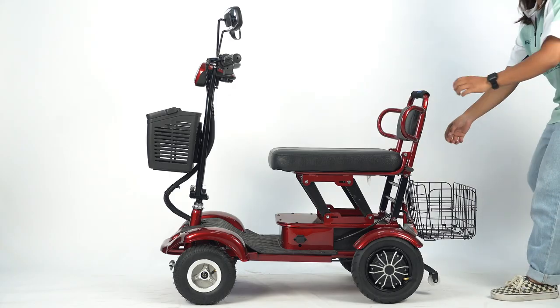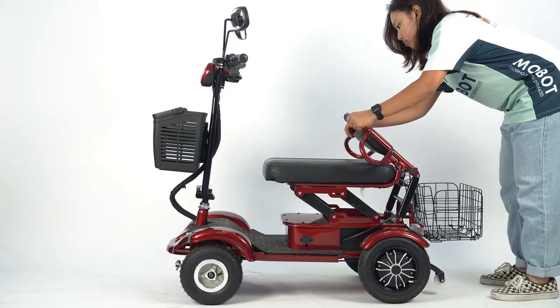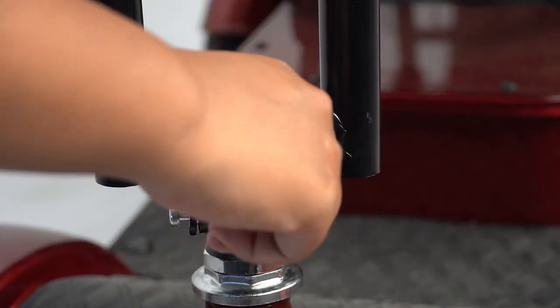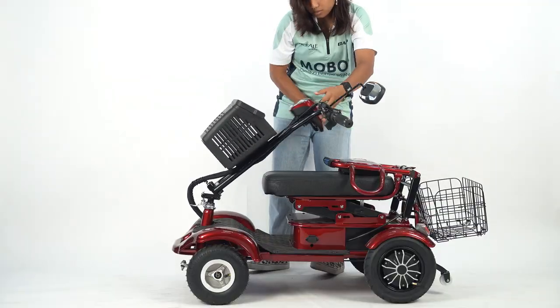Folding: Unscrew the screw, push the screw to the left, and push the chair down. To fold the front handle stand, release the metal screw, push the metal tip, and push the handle stand down.